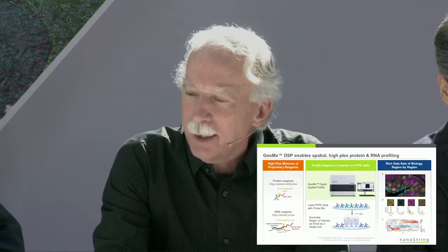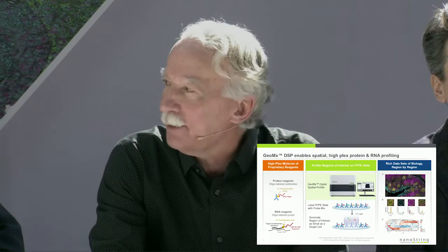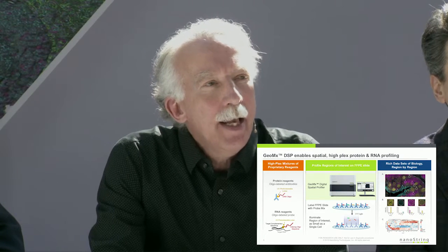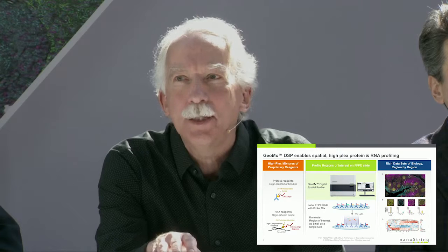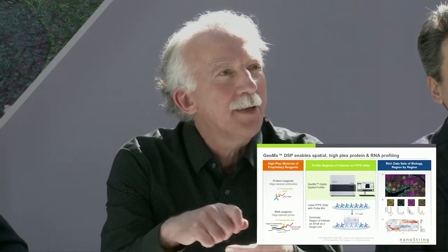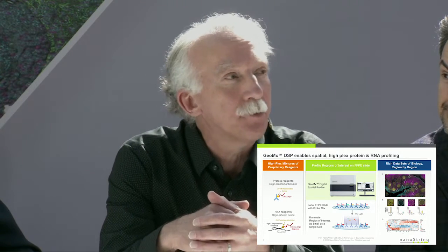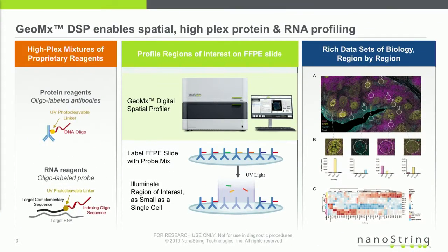A lot of us just came from the American Association for Cancer Research meeting in Atlanta a couple of days ago. And it was literally 5 years ago, almost to the date, in 2014, that a professor from MD Anderson, Gordon Mills, and I scratched out on a napkin essentially what are the essential features of the digital spatial profiler. I'm trying to highlight them here on this particular slide.